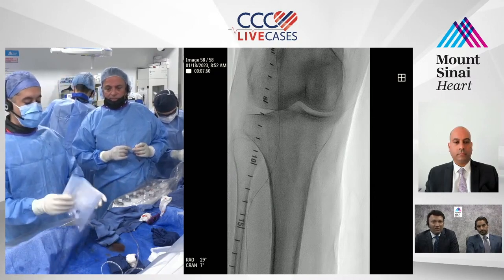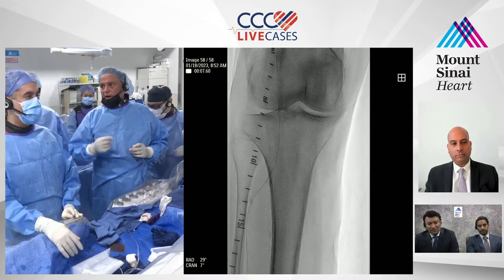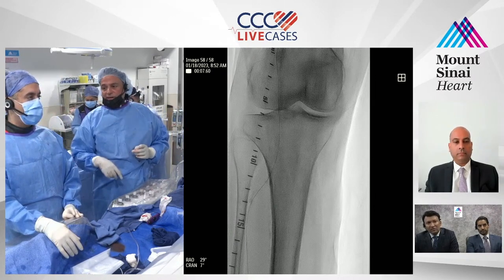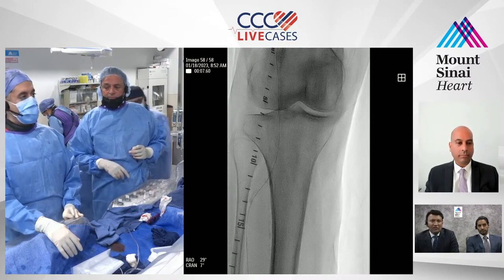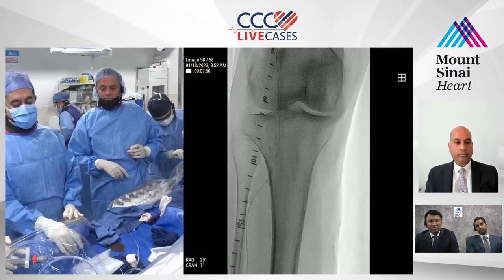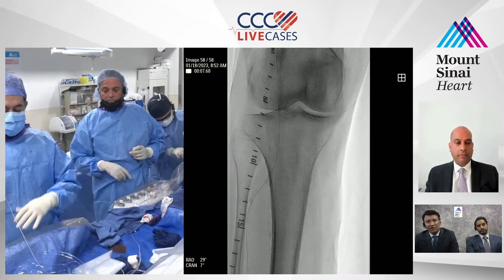Okay. Where would you stick the SFA? I just stick the SFA. SFA, micropuncture. Yeah. And just put a wire down and then track it down, and then we can either re-enter at the pop and work from below. Yeah. Just put a pedal access kit. I mean, a pedal access catheter there, which is 2.4 French. A Cook sheath. Cook sheath. And then use a coronary balloon and dilate it.